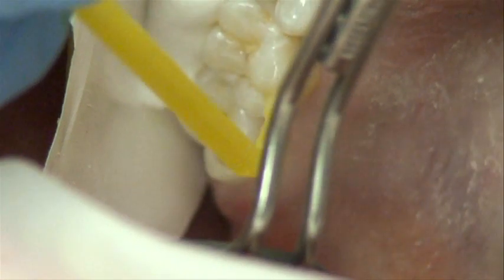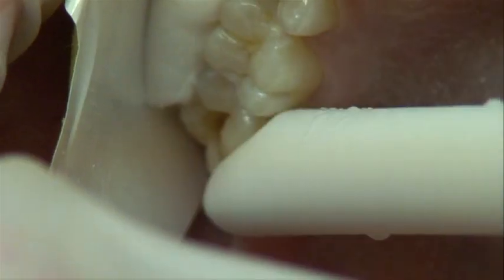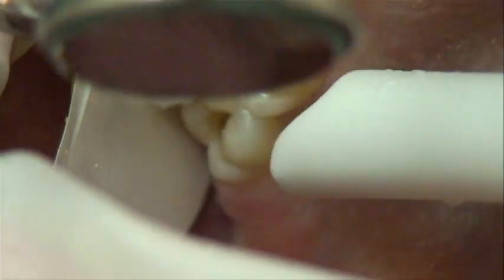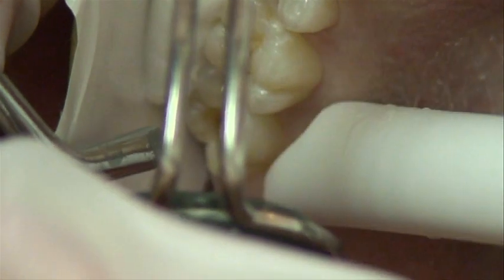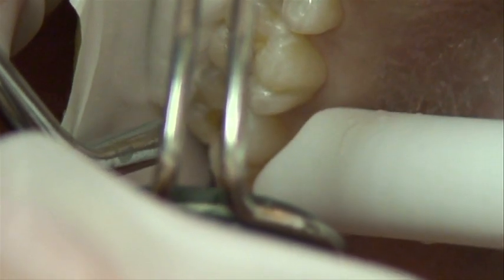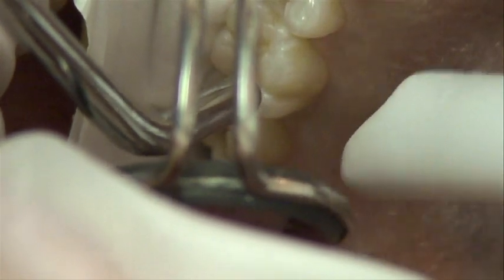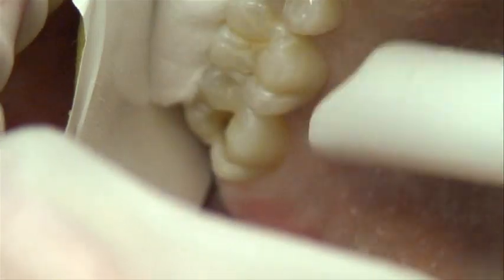And depending on if you're using a 7th generation bonding system, in other words, all in one, after you blow the solvent, as you see me right here, you're going to be done. You can cure with your light. If you're using a 6th generation, then after you get rid of the solvent, you are going to apply the bond. So very, very important that you get rid of the solvent.